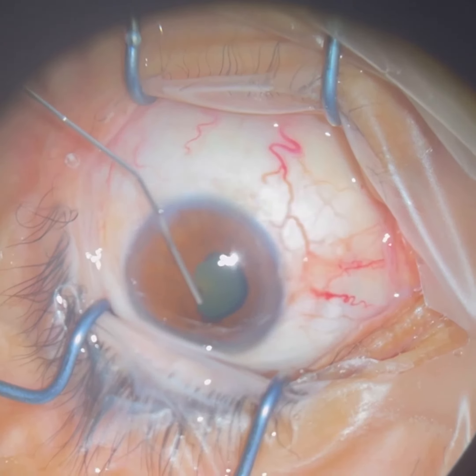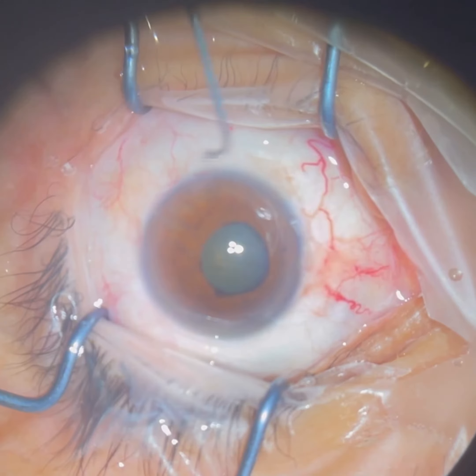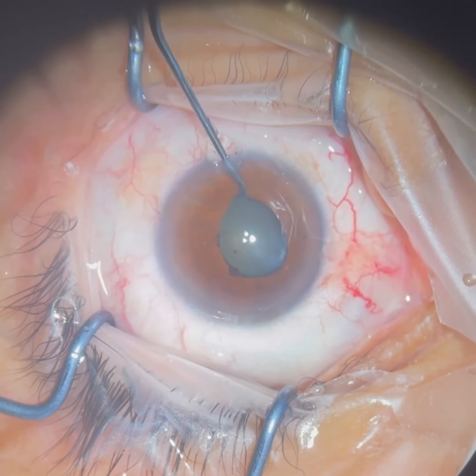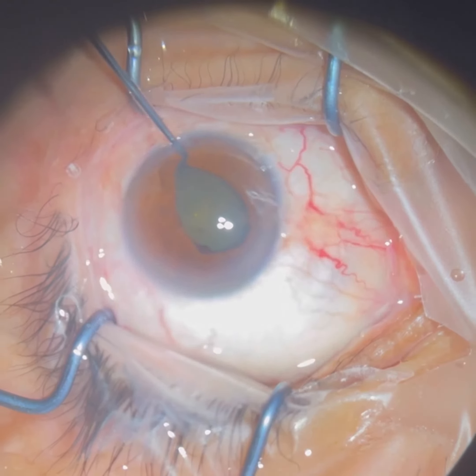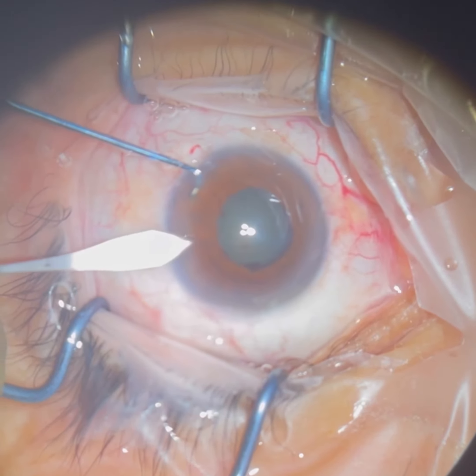What's interesting about this patient is that you see the pupil is very small — it did not dilate normally. Usually for cataract surgery we dilate the pupil. This patient has a history of inflammation in the eye, which creates scar tissue to form between the iris and the lens.